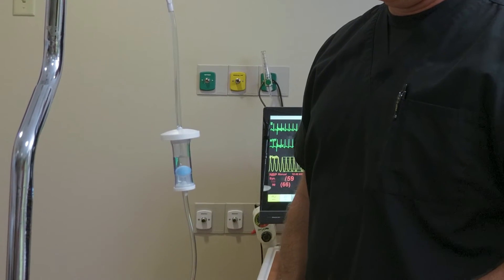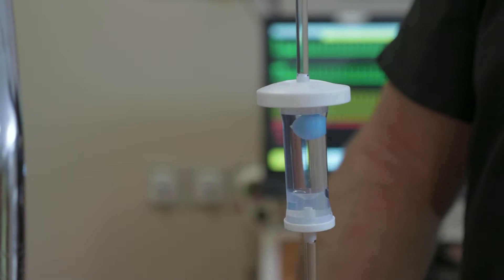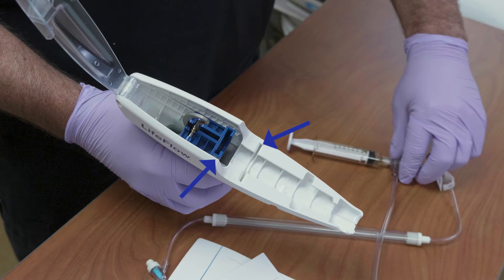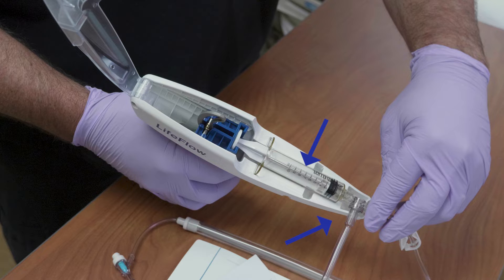Allow the air check to fill completely. If needed, squeeze below the air check ball to release it. Open the canopy on the LifeFlow handle and insert the syringe as shown. Note that the milliliter markings on the syringe are visible and that the inlet tubing fits into the notch on the right side of the handle.